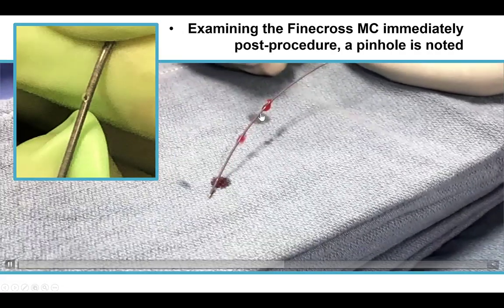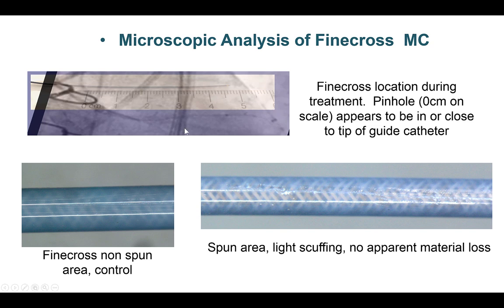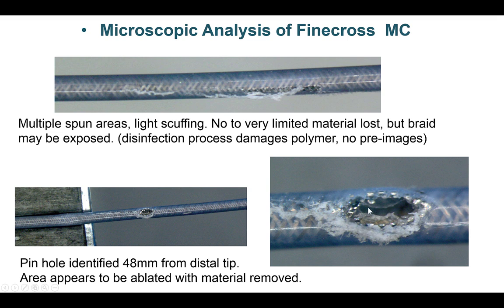We then examined the FineCross microcatheter that we had used to protect the LAD wire, and interestingly, there was actually a hole in the FineCross. Under higher magnification, you can see the FineCross body, and further down there is some scuffing, but going further still, there is an area of actual perforation — despite the FineCross having a metal coil, the metal was destroyed and there was a hole. This demonstrates the potential risks of using a microcatheter to protect a guide wire during atherectomy; the atherectomy can damage the microcatheter and potentially lead to material embolization, or even fracture and distal embolization.